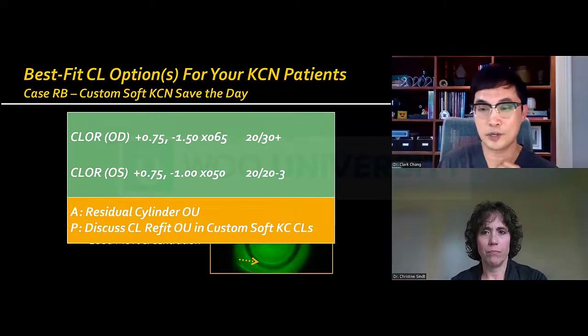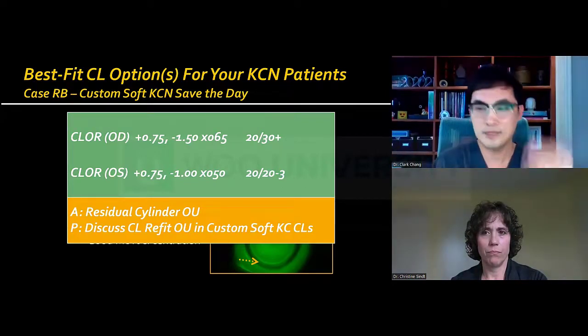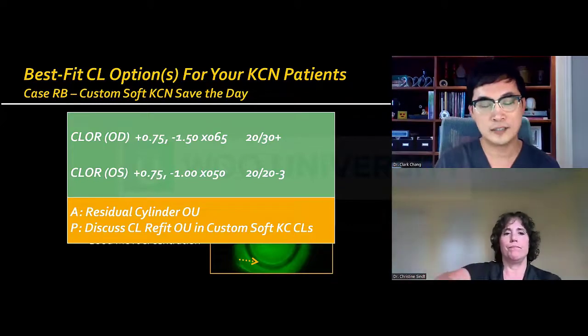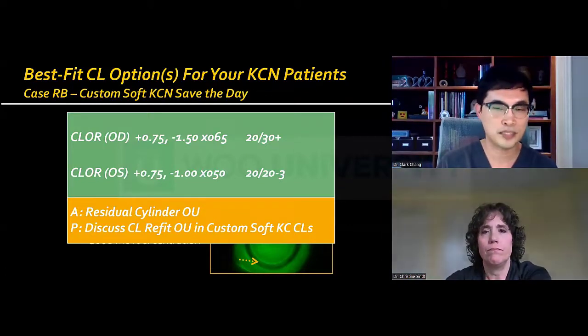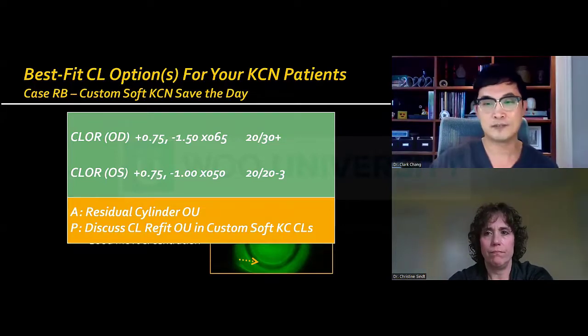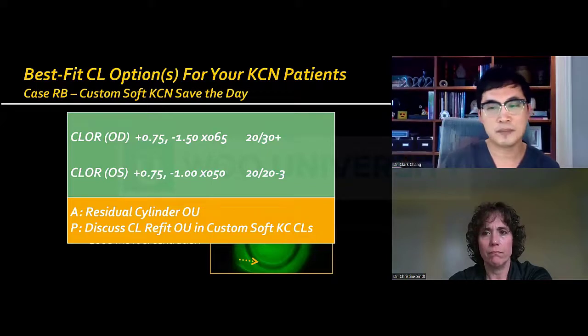Maybe just continue to wear your hybrid lenses. Since you like your glasses quite a bit and you need your progressives anyway, maybe just wear that over-refraction in your glasses and I'll prescribe you progressives. I can do that, but I would really prefer, for my distance vision, I'm outdoors all the time. I don't mind putting on reading glasses. There's something else you could do.